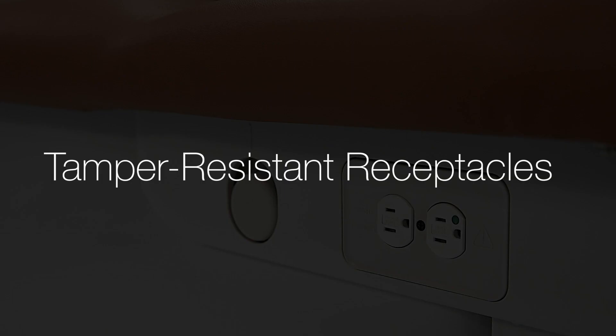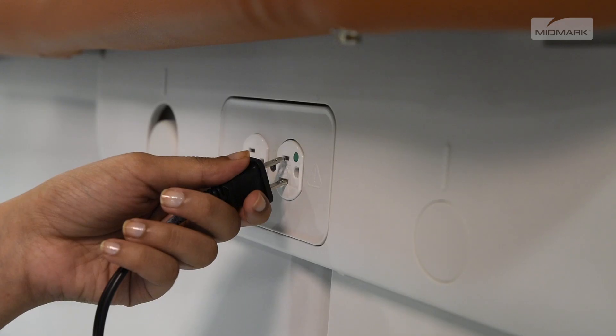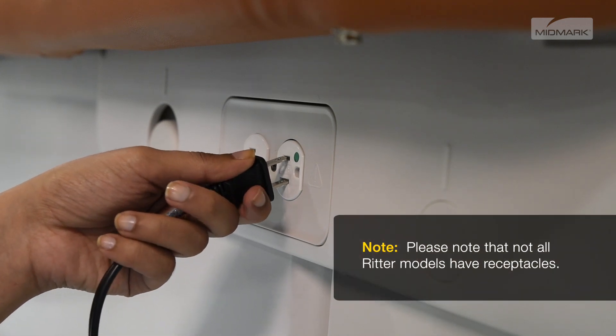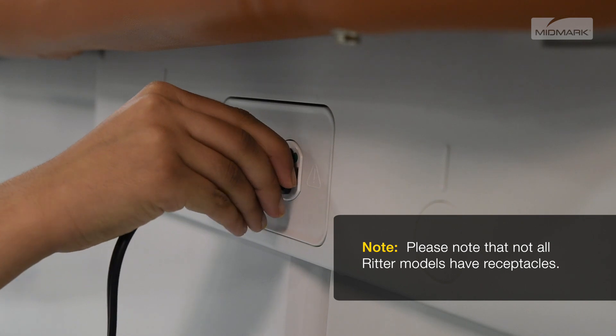Receptacles on each side of the chair provide power for accessories used during medical procedures. Spring-loaded receptacle cover plates protect electrical contacts, preventing the insertion of objects when unequal pressure is applied to the receptacle's contact points.